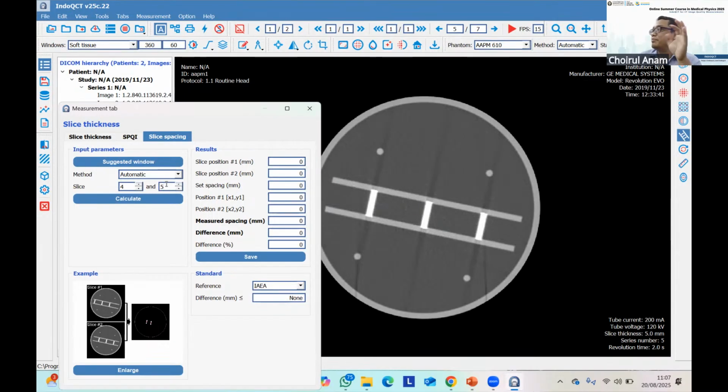If we have many slices, you can decide what you want. For example, if we have maybe 5 slices containing the object, we can set the slices as you want. Because in this example we only have 2, we have chosen correctly. This is number 4 and number 5.